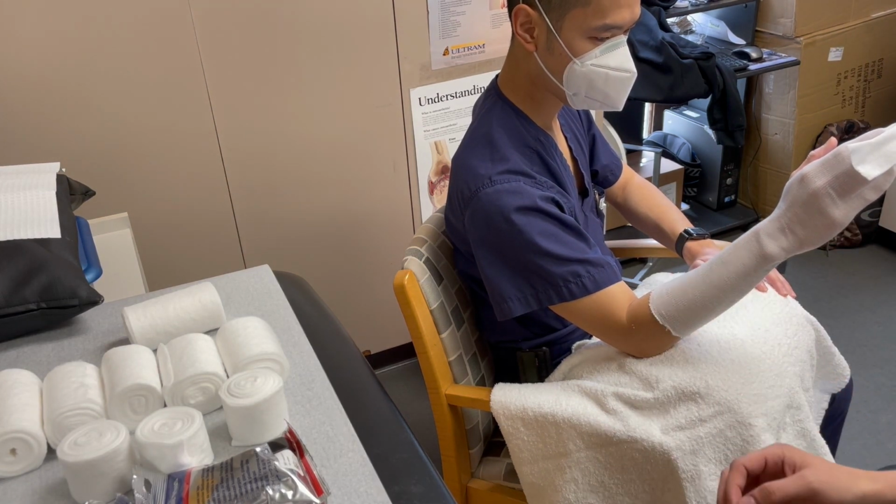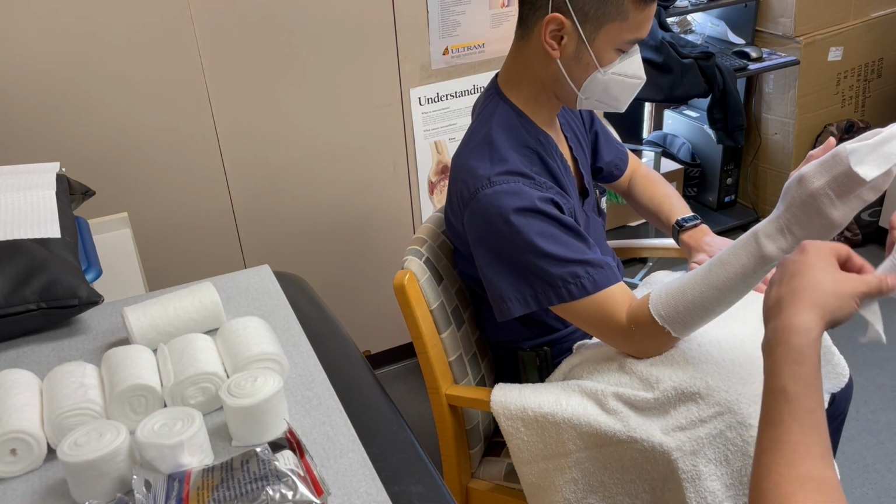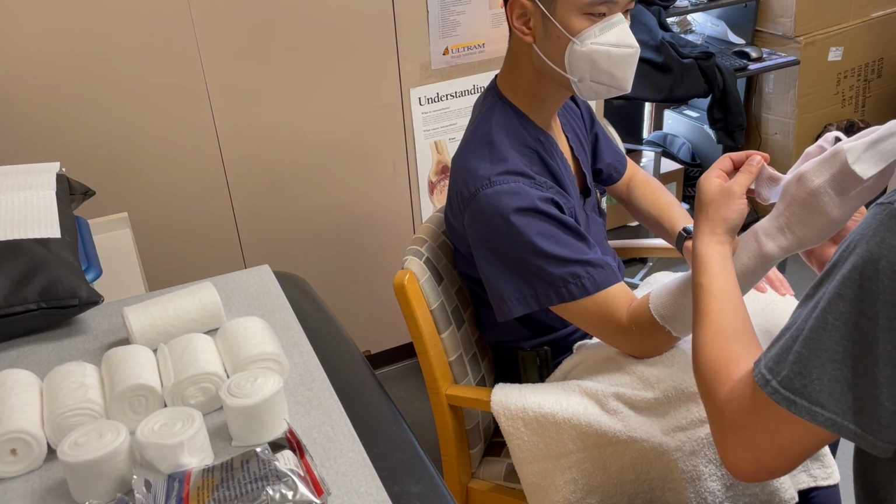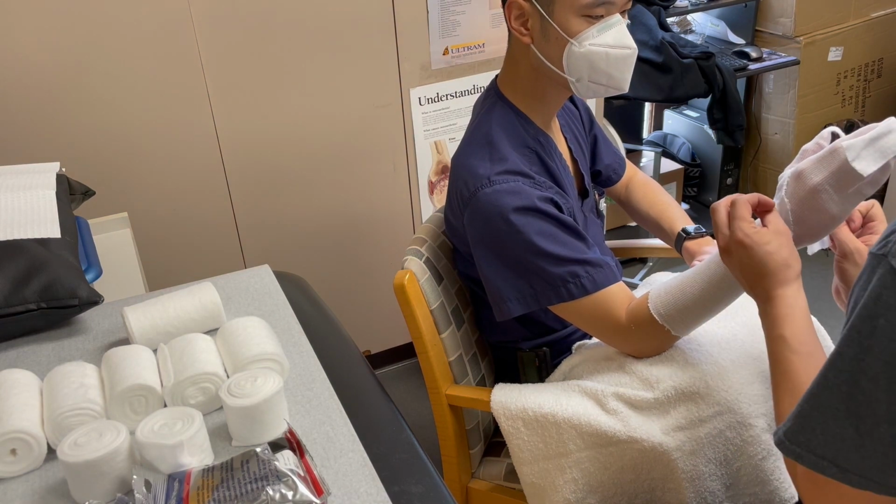You can apply the stockinette over the thumb for a thumb spica. Now if we were doing a short arm cast, we can roll down the stockinette and expose the thumb.